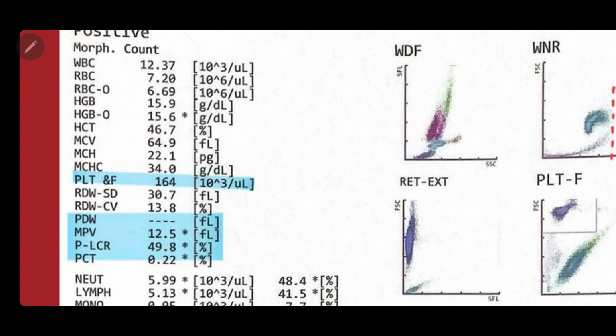However, it's essential to note that some blood test machines have a technique that can lead to misdiagnosis, as they draw a line to indicate the position and corresponding PDW value. In reality, it should state that PDW cannot be measured accurately.